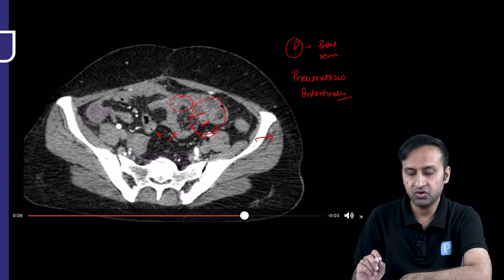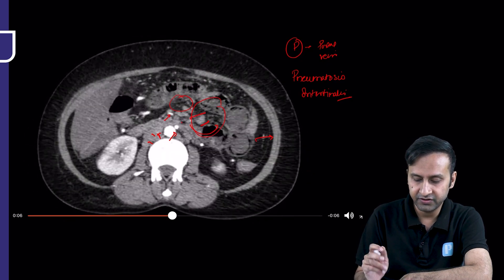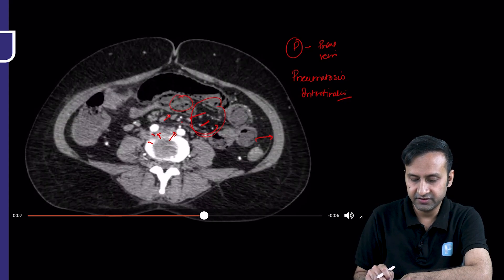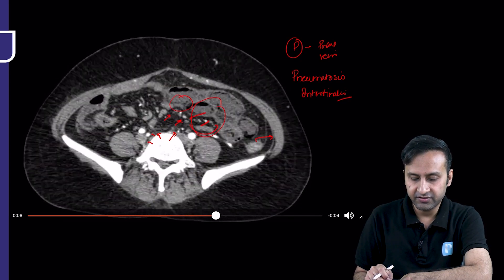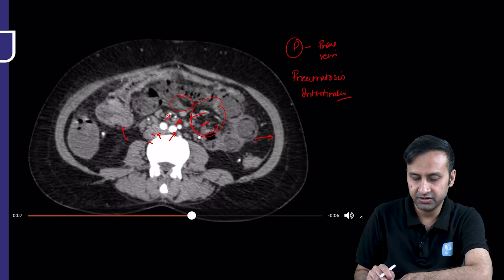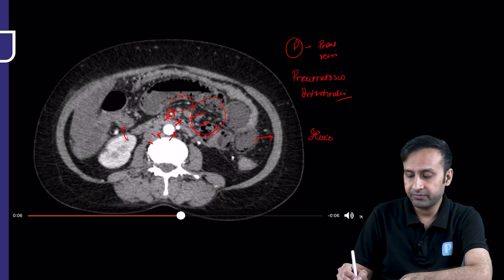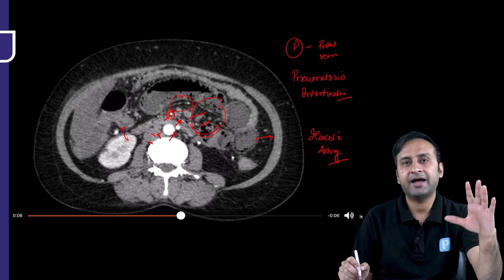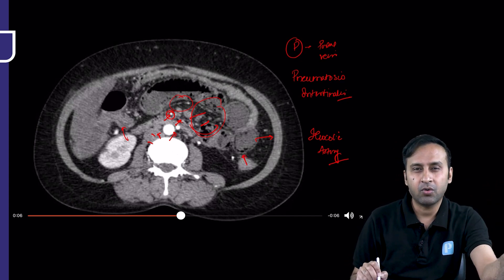Going further down, the ileum does not look abnormal — it is not dilated and shows normal wall enhancement. This is because the iliocolic artery is somehow getting its blood supply through collateral circulation, with even a small terminal SMA branch getting flow. This prominent trunk — the iliocolic artery — is patent, so the ileum is well perfused and is not undergoing gangrene or pneumatosis.